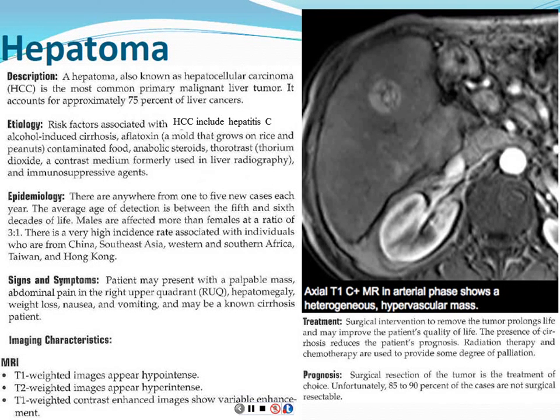So this is important for you guys to know, that this contrast agent only really works well in a functioning liver. And typically the patients who are going to get a hepatoma, they have cirrhosis and their liver doesn't function well. So whereas you and I will definitely be excreting contrast into our bile ducts by 20 minutes, a person with cirrhosis may not excrete enough to create a reliable examination within 20 minutes or even 30 minutes. So sometimes you may have to wait longer. Sometimes it's just not going to ever be useful if their hepatocytes can't process the contrast as well.